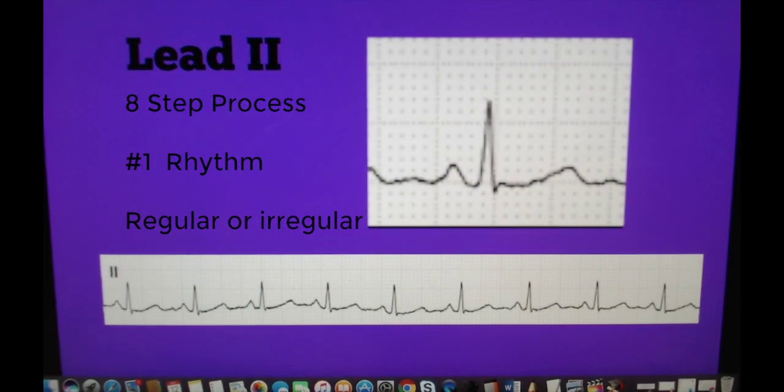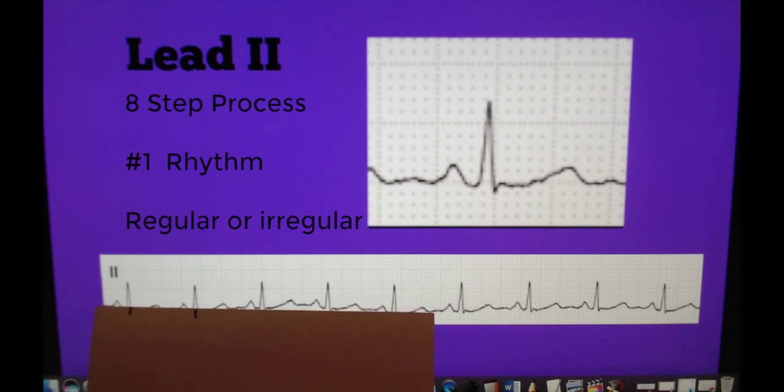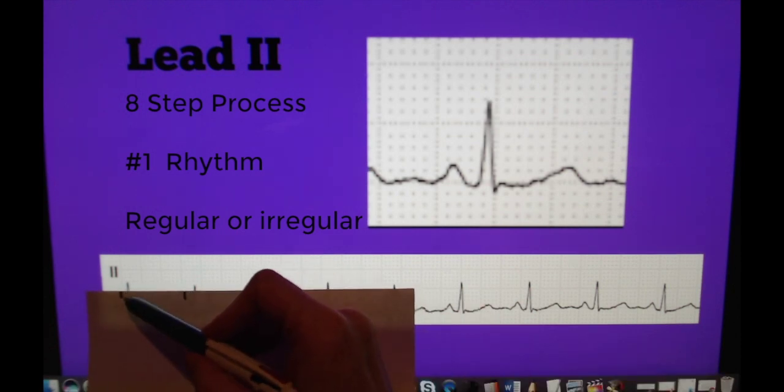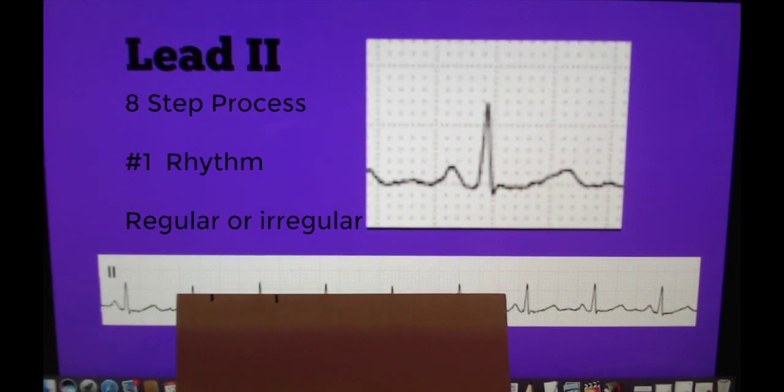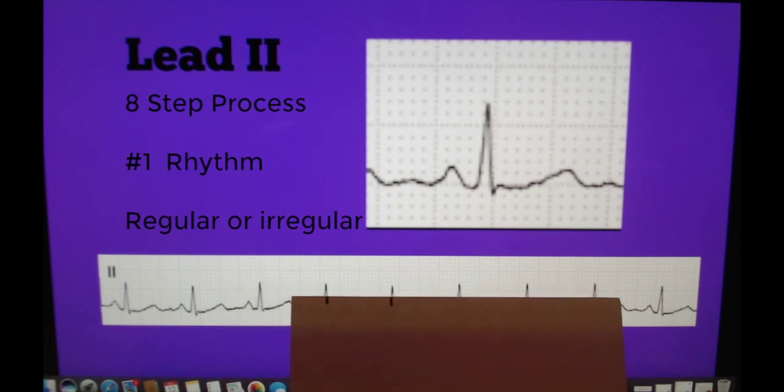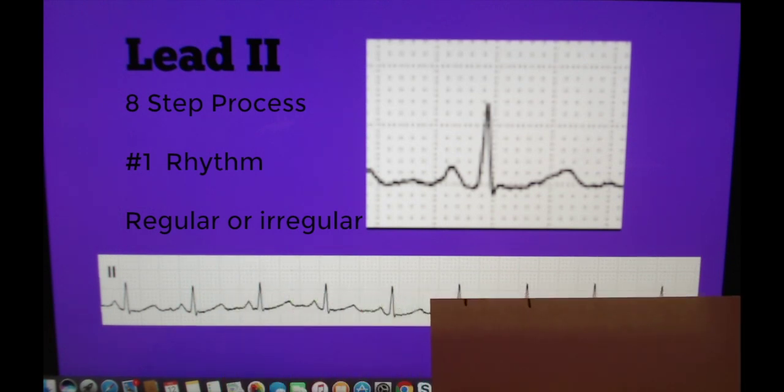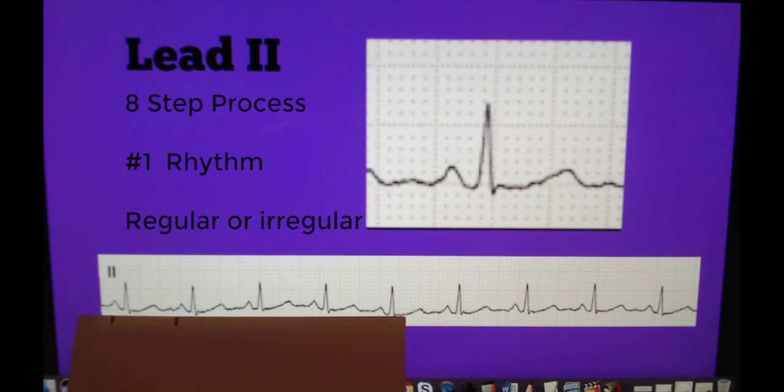Or we can use a piece of paper if you don't have calipers and you just mark it. I have already pre-marked mine from your R to R and then you are going to take this all the way down your six second strip to identify if we have a regular or irregular rhythm. In this lead we do have a regular rhythm for the ventricle contraction.